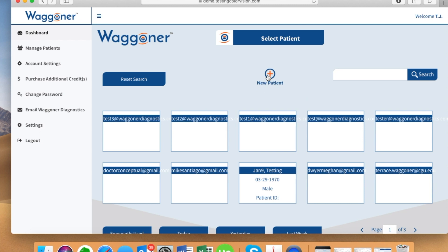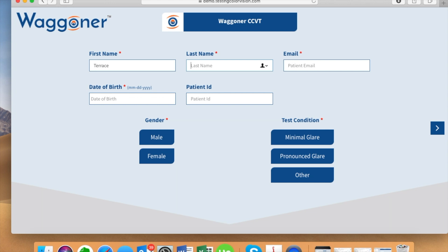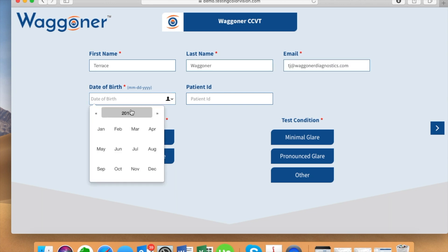If the individual has been added before, you can find them either through their email address or name. Today we are going to add a new patient. Enter all of the information for the user on this page and then select the arrow on the right-hand side.